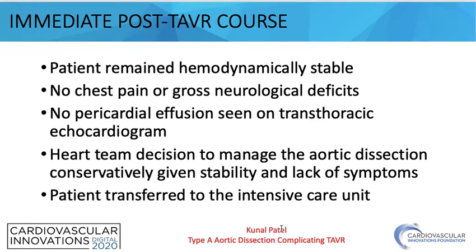At this point, we lightened the patient's sedation as she was under conscious sedation, and we determined that she was neurologically intact and free of any chest pain. Her hemodynamics were normal and stable off all vasopressors, and we performed a transthoracic echocardiogram, which showed no significant pericardial effusion. So we decided to take an initial conservative, non-operative approach, and the patient was transferred to the ICU.